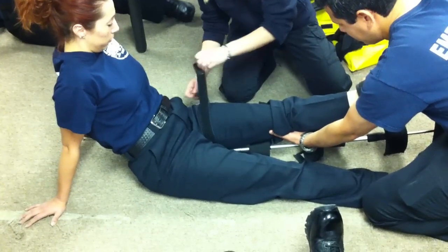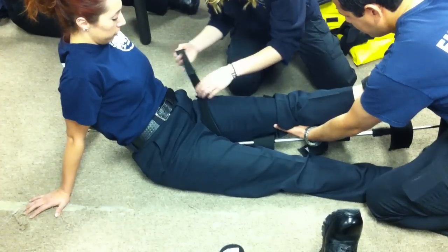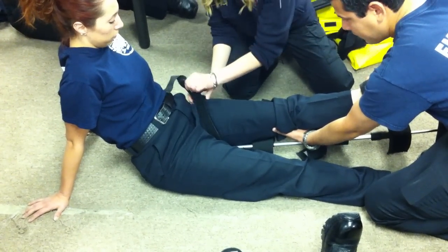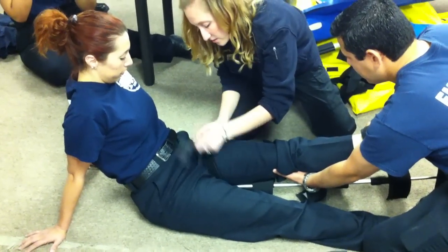Okay, what's next? Secures groin strap. We've got this groin strap, which will be up in the pelvic area. Ask gentlemen to please move their boys aside. Pad this if they need it, and then secure it.